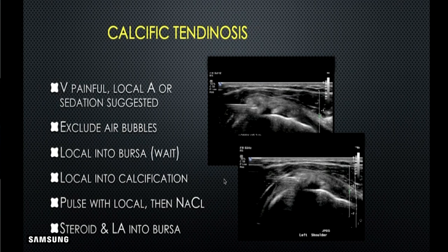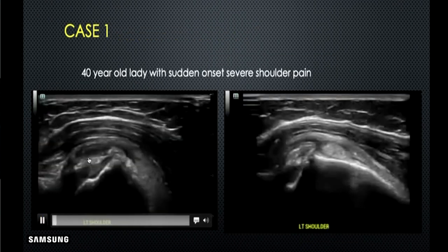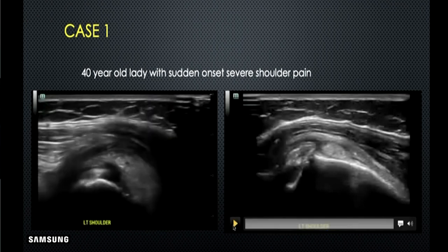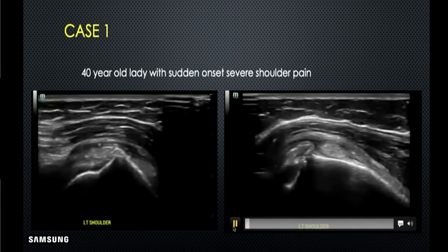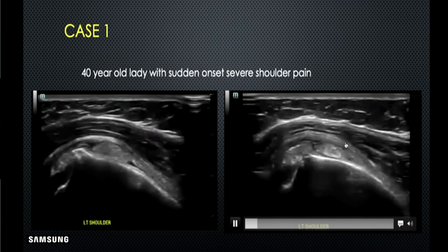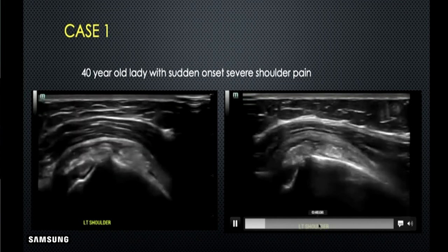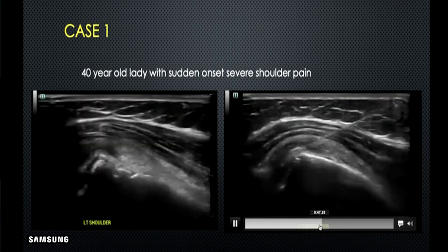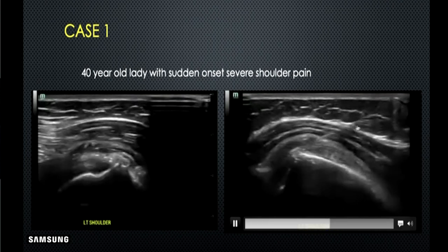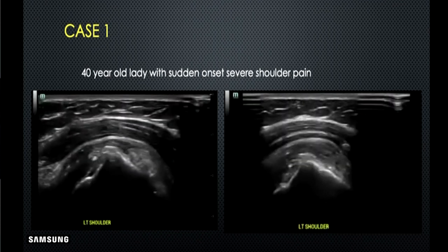On ultrasound, this is how the calcification looks in the rotator cuff — partly within the tendon and partly extruded into the bursa. First, inject a good amount of local anesthesia, around 2-3 ml. The needle comes in and you inject within the bursa, within the skin, subcutaneous tissue, and around the calcifications. This gives immediate relief to the patient.